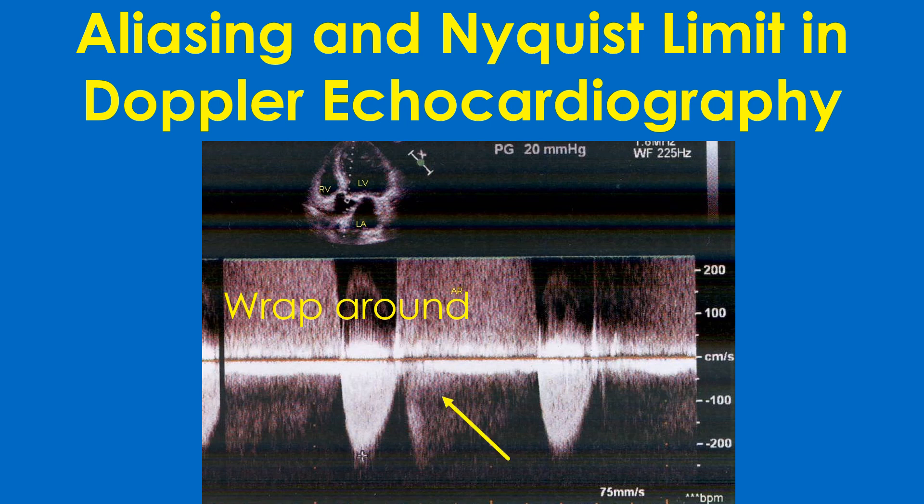In this high pulse repetition frequency Doppler recording showing an aortic regurgitation jet above the baseline, a cutoff is seen at the upper end with a wraparound below the baseline. Aliasing is seen here because the velocity limit has been set just above 200 cm per second while the actual jet velocity is higher than that.